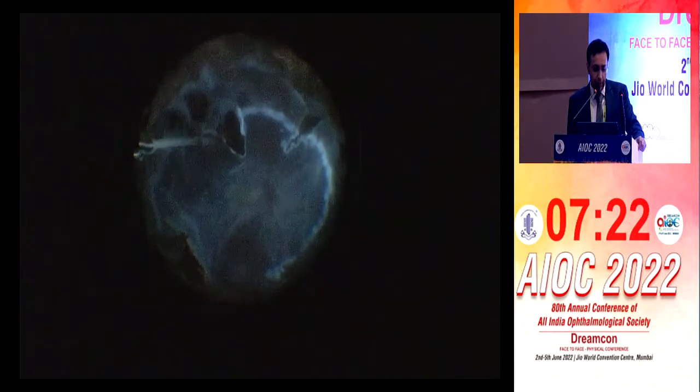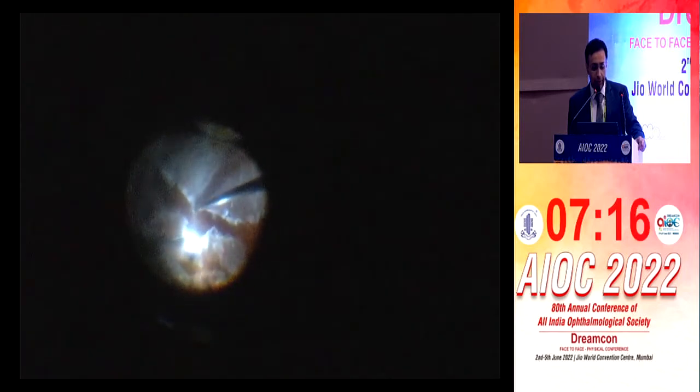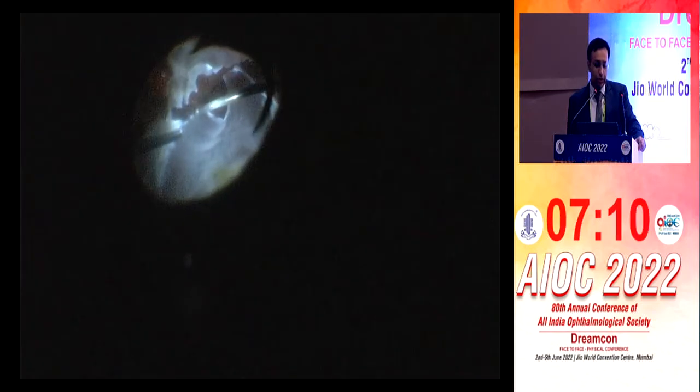He's now cauterizing the edges, which is good so that bleeders don't happen from the retinal vessels. Any area which is anterior, it's important to excise it completely. Because if you leave it, it goes and attaches to the ciliary body, and then there's always some hypotony in these eyes.